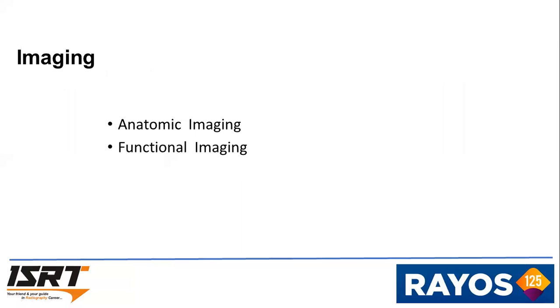Coming to the imaging side, the imaging can be divided into two: the anatomical imaging and the functional imaging. The anatomical imaging is to visualize the anatomy and detect a lesion if any. The functional imaging is not just finding a lesion but to characterize a lesion already detected.